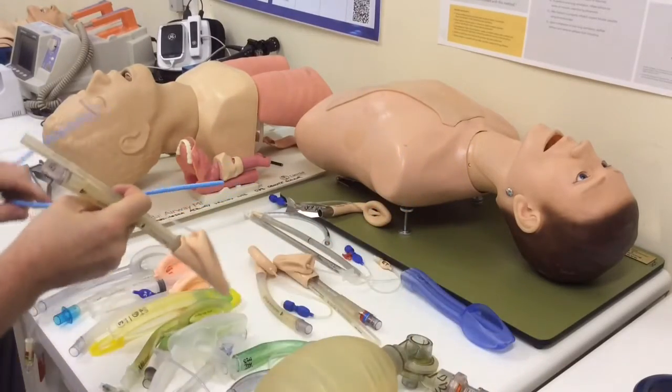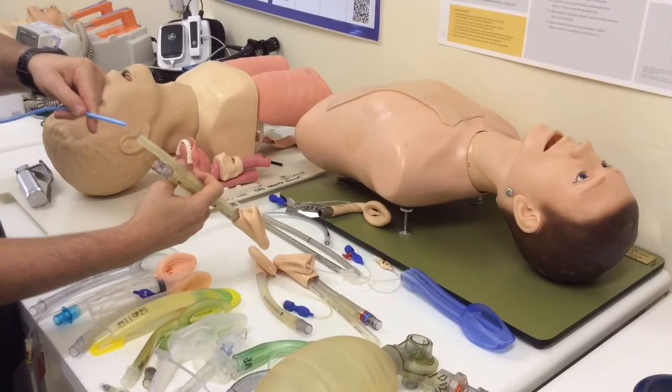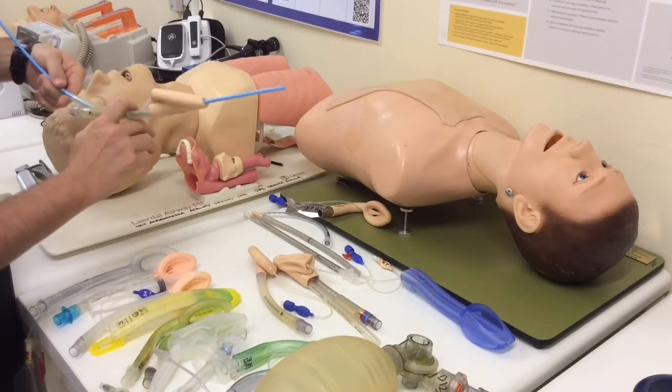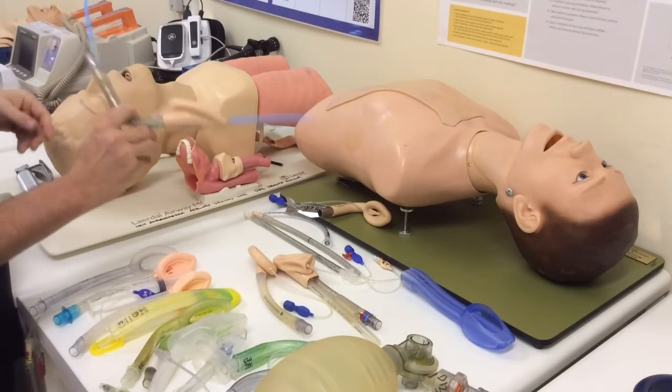So you take your supraglottic airway and you well lubricate your gastric drainage channel. I'm putting this through the gastric drainage channel, with the tip of the bougie sticking out there, and then I can do almost like a shocker grip to hold that in place.